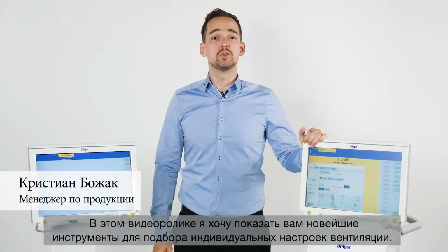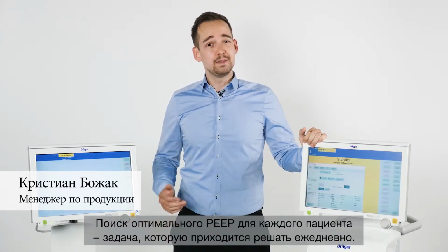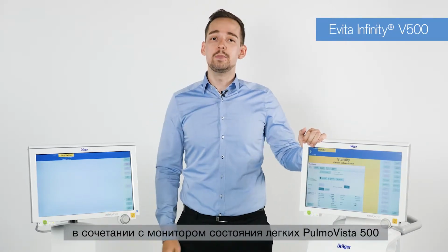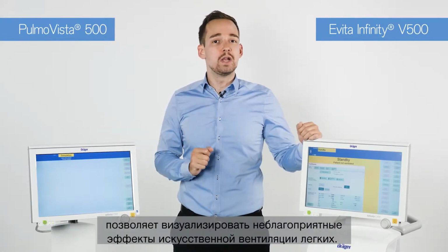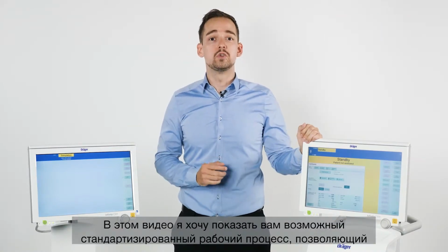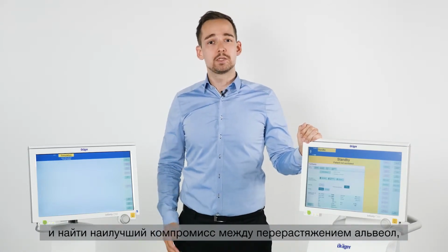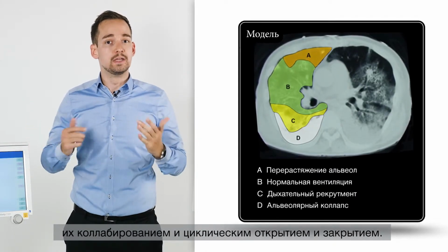Within this tutorial, I want to show you the latest tools for personalized ventilation. Finding the best PEEP for each individual patient is a daily challenge. The Evita Infinity V500 ventilator, in combination with the lung function monitor PulmoVista 500, allows to visualize the adverse effects of mechanical ventilation. In the following video, I want to show you a possible standardized workflow to analyze the lungs' response to different pressure levels and to find the best compromise between alveolar overdistension, collapse, and cyclic opening and closing.